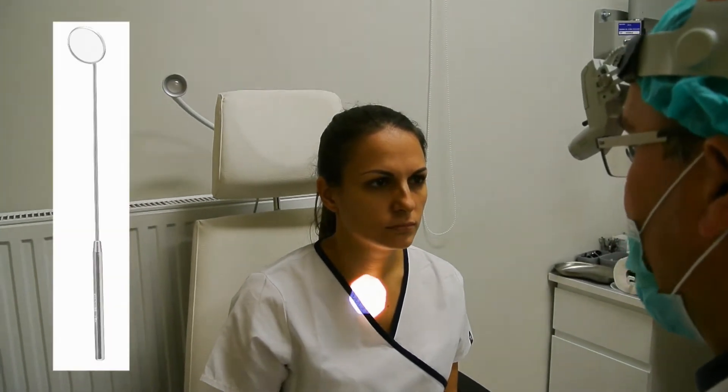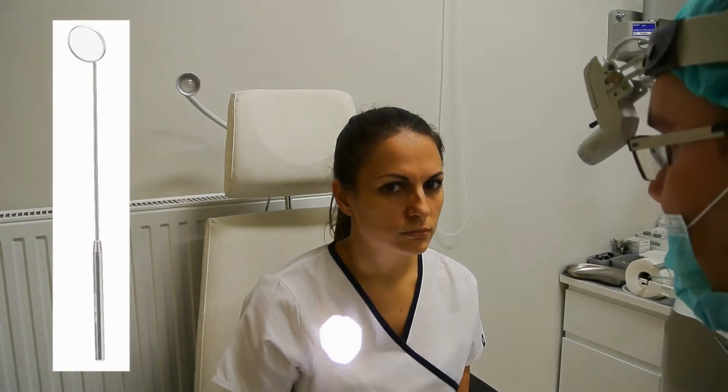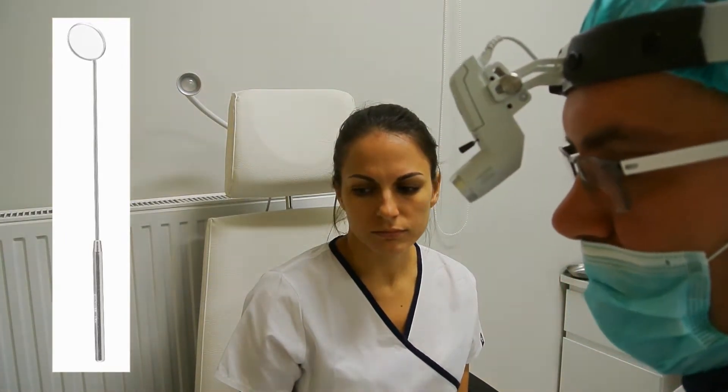We can examine the larynx many ways. The traditional way to examine the larynx is with the headlight and laryngeal mirror.